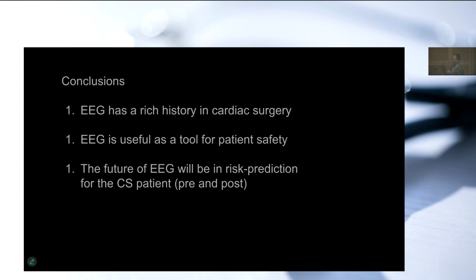By the time you're anesthetized, you've already dropped down about 40% from your basal CMRO2 to something lower. The transition from burst suppression to isoelectricity is only associated with about 10%. So I guess the question is, if you have isoelectricity, change nothing. You don't necessarily need to decrease. It's not harmful at that point, but you certainly don't need to increase. If you have burst suppression, then if you want to eke out that last 10%, it would potentially be worthwhile to increase your anesthetic administration. But we do not have any outcome-based evidence to suggest that matters for cerebral protection, sadly.